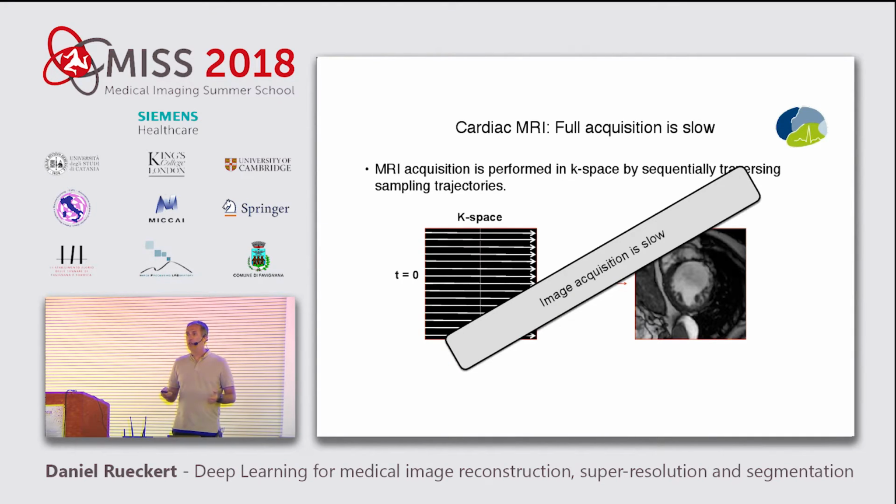The only problem with the MR system is I can measure in one direction very, very quickly because of the MR physics. But moving from one line of k-space to the next line unfortunately takes some time. And that time, in order to traverse the entire k-space, means that I have to spend a certain amount of time collecting all that information. After I've done this, the reconstruction is almost trivial if you use fully sampled data. You simply apply the Fourier transform to get back to your image.